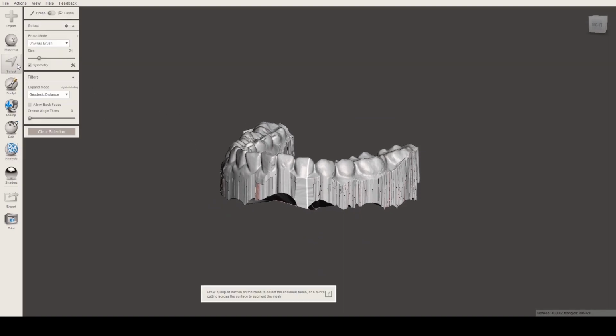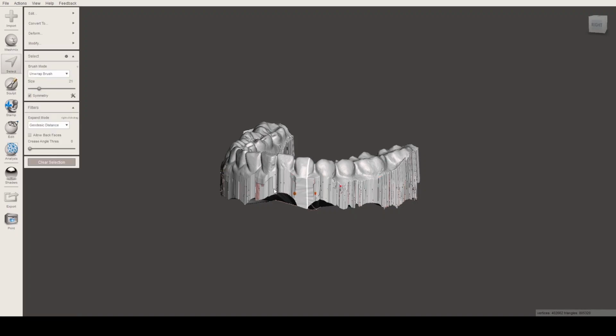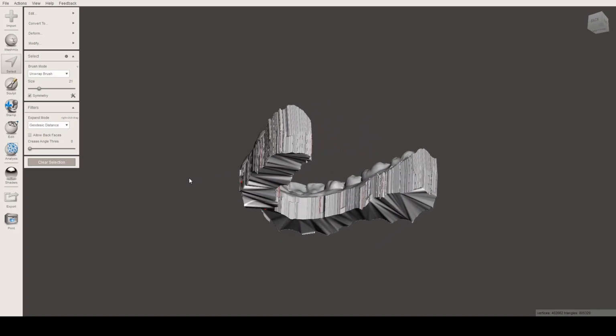This is how far I'm gonna go. If you have questions, you can ask me. You can research more about Meshmixer, but what you'll see in this video is the most basic functions of Meshmixer, which is what you guys are gonna use with intraoral scanning. You should learn it as a skill. It's never a damage to have more knowledge, you know.